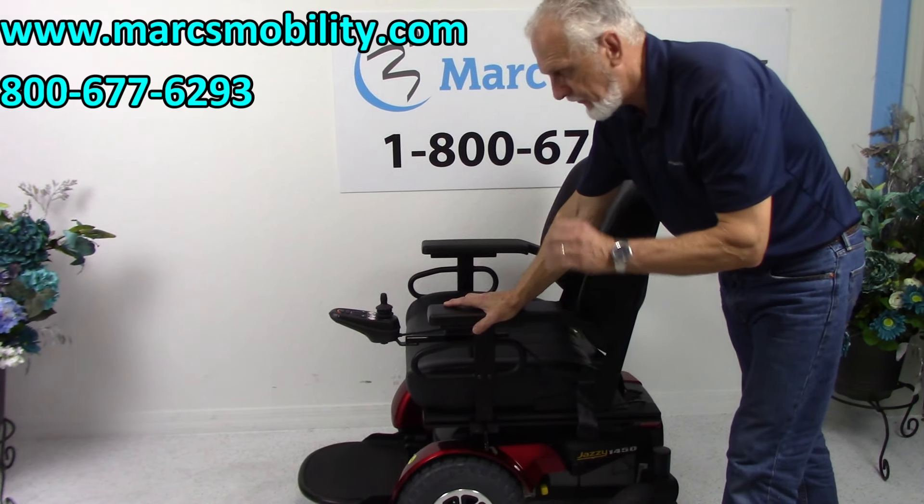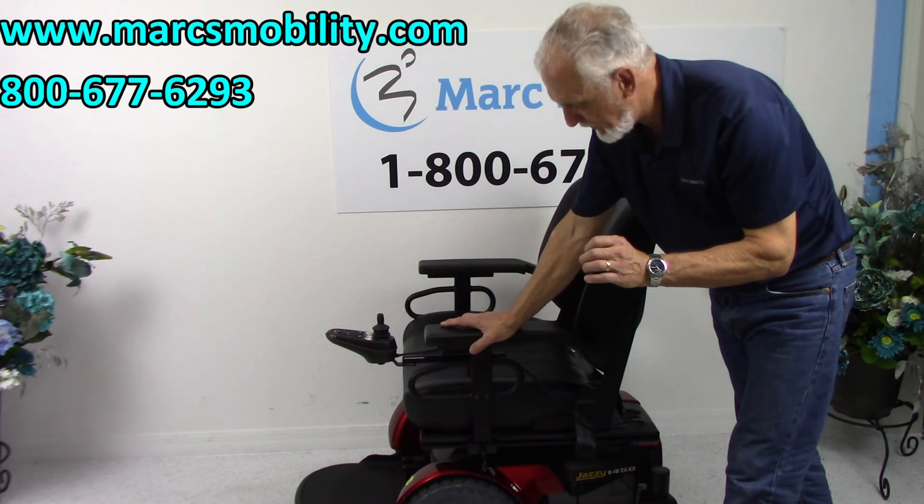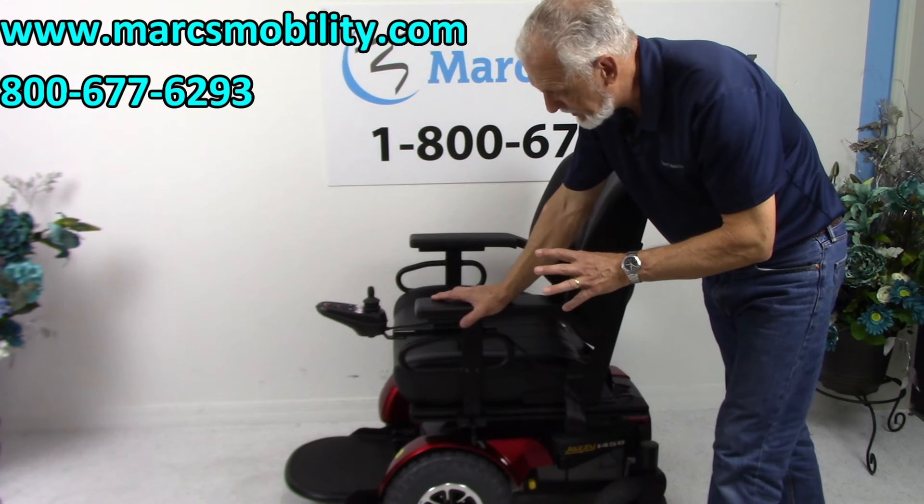This is a Jazzy 1450 HD. This is an extremely heavy-duty power chair, built like a tank. This is the big one that Pride Mobility makes.